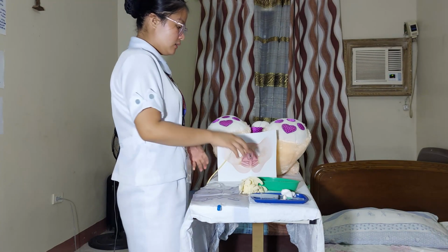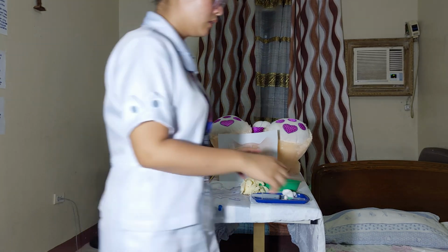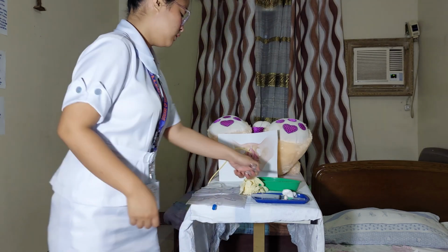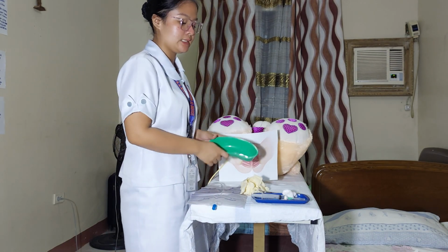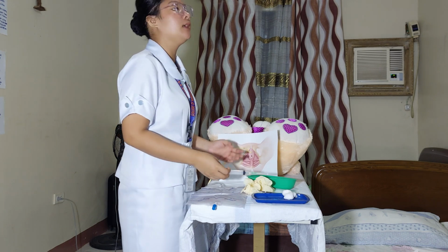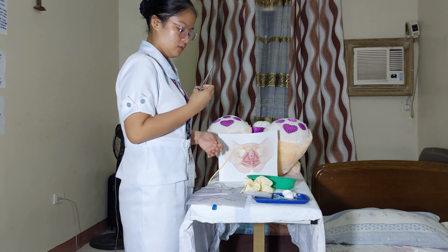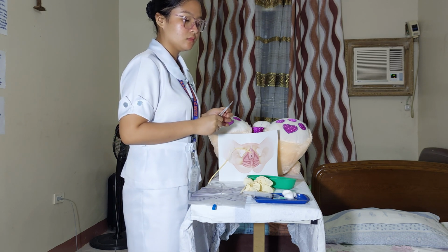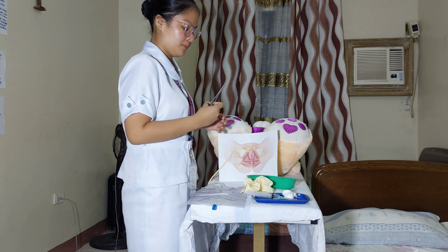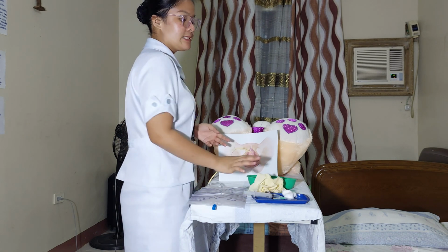So now I'm going to do the removal of the catheter. Now we are going to remove the retention catheter. The equipment that we are going to use is a kidney basin, a syringe to deflate the balloon, cotton balls for drying the genital area, and disposable gloves. Just like the insertion of the catheter, we are going to assess the patient's identity and the doctor's order. After that, we're going to prepare the materials needed.